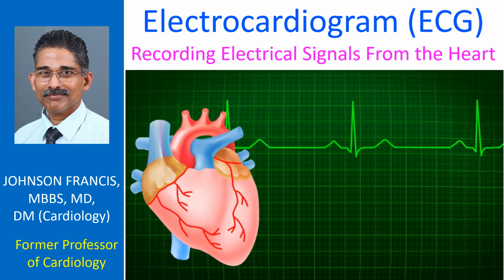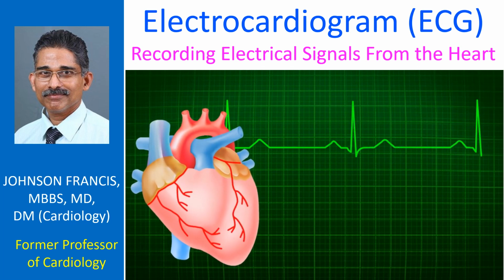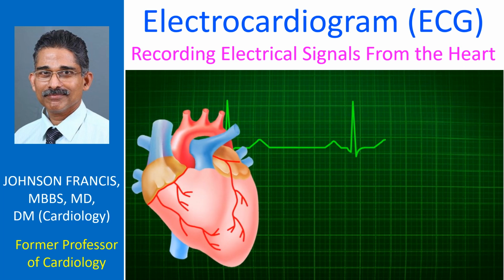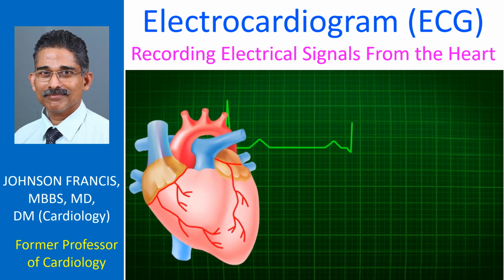The modern electrocardiograph was invented more than a century back. An electrocardiograph records the electrical activity of the heart from the surface of the body. It is one of the simplest and widely available investigations to assess the heart.